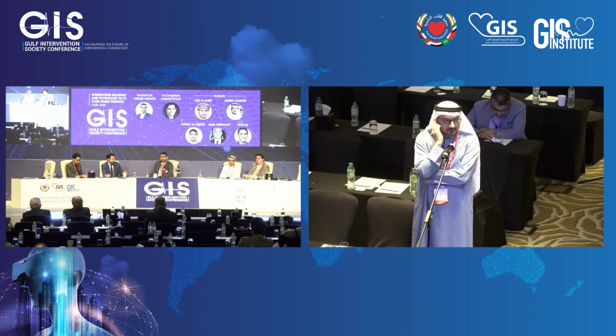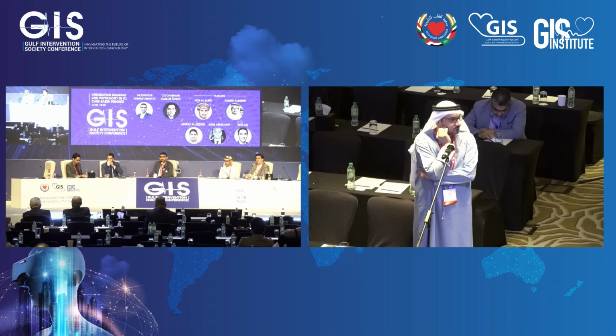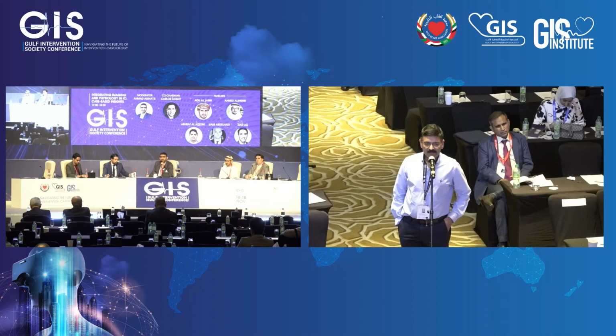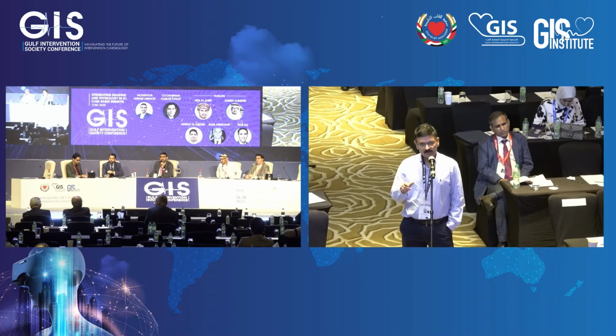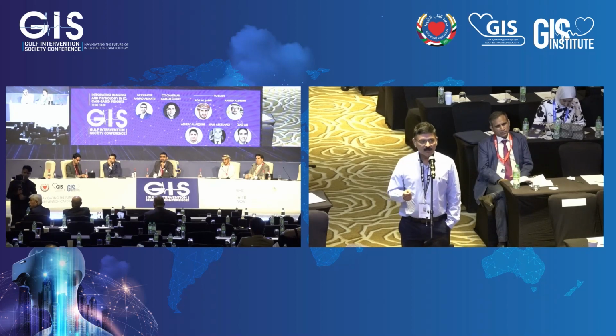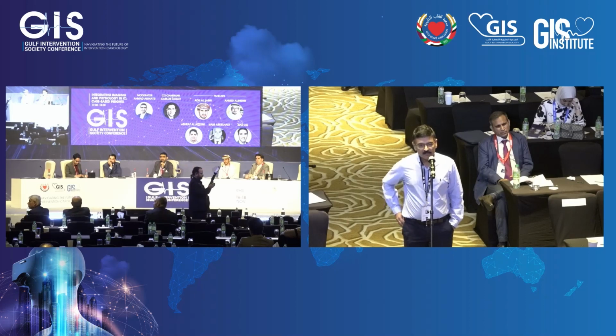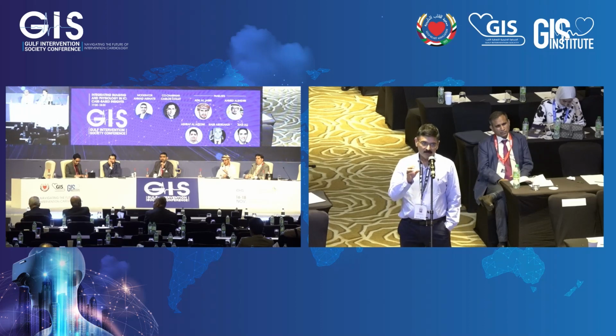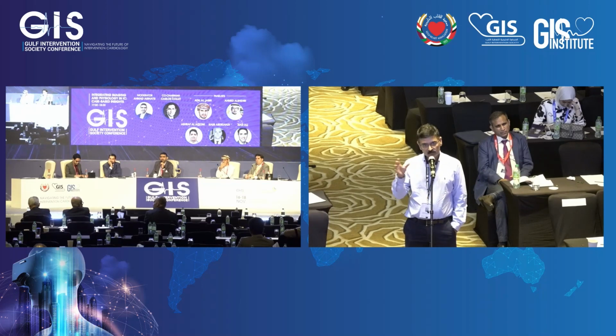Yes, please. I have a question. We do know, I think, from the subset analysis of TARGET FFR, that if you do a post-PCI physiology, diffuse lesions have much less incidence of iFR greater than 0.9 or 0.89. But it is not an all or none phenomenon. There are some people in whom you do get benefit and it normalizes.